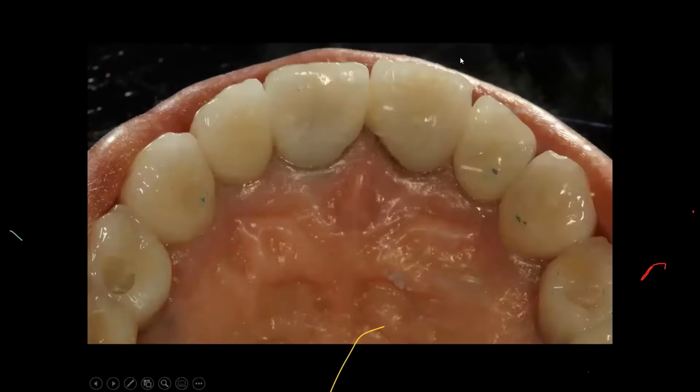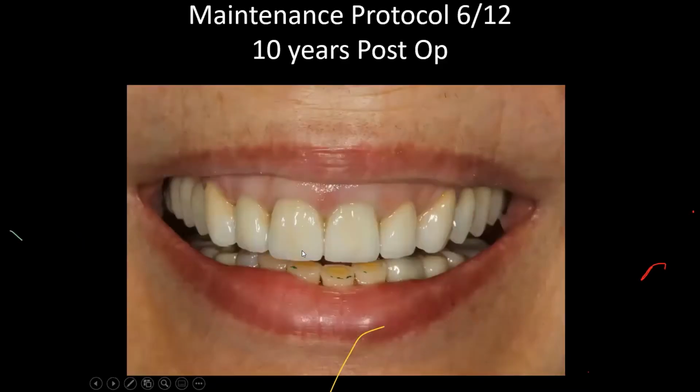And in this particular case, I have very, very minimal contact. I can pull through. You can see the little dots here. That is just on the lateral, okay? And canine stops will remain, as with the implants all the way to the canine, with minimal contact. Only with strong, hard clenching will I have a contact on the anteriors. So this is 10 years post-op. I believe we've maintained quite a good aesthetic integration. Sure, the lower anteriors need a look, but she's quite happy.